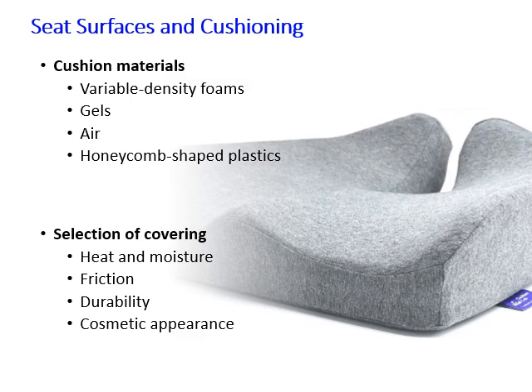honeycomb-shaped plastics. I actually sleep on a purple mattress, which has a similar idea of what I'm talking about, the honeycomb-shaped plastic. It's a specialized plastic that conforms to the shape of my body when I sleep. And I love my mattress. So there are seating systems that are made out of similar material.